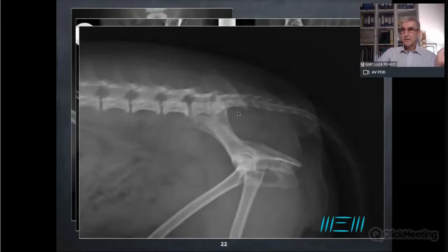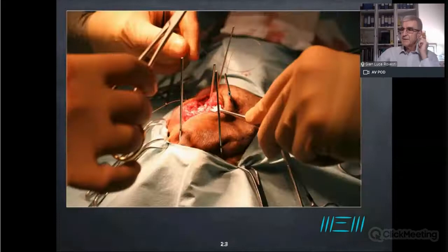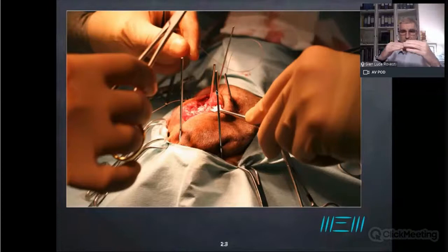So I decided to put this K wire here. This is a K wire inserted from proximal to distal. Once we had the fracture aligned and the two fragments superimposed, we inserted this K wire in order to stabilize temporarily the fracture. Once the fracture was stabilized temporarily, the approach was lateral, dorsolateral to the ilial wing, so quite an easy, straightforward surgical approach.